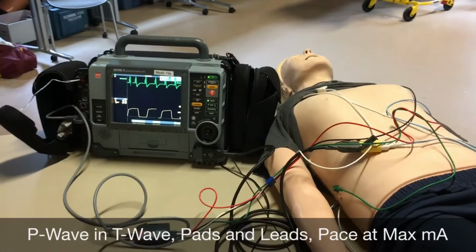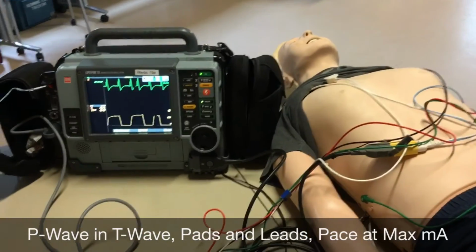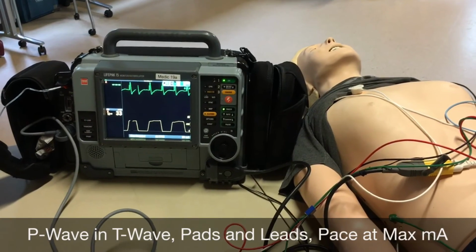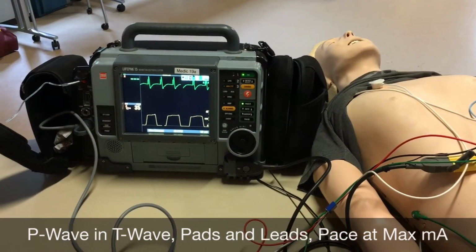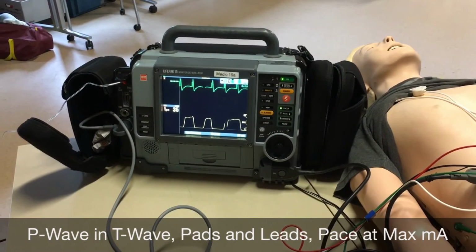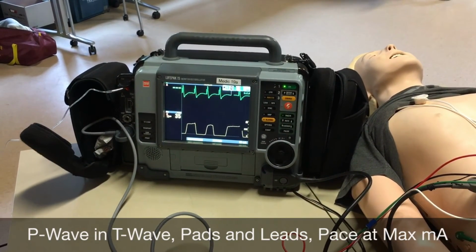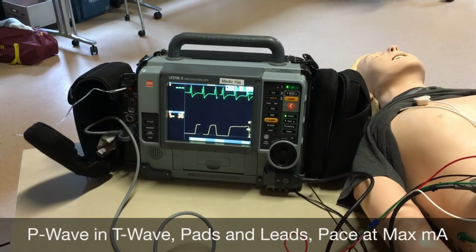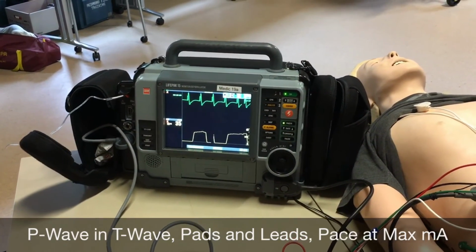And three, we now know that there's an easy, fast way to know whether or not you're ever going to get capture, and also to get capture immediately. If I go all the way up to 200 milliamps and I don't get capture, then I need to do something different. I didn't need to spend more than 2 seconds to figure that out. And if I have capture, I can back it down until I lose capture and then bump it up a little bit to hold capture.